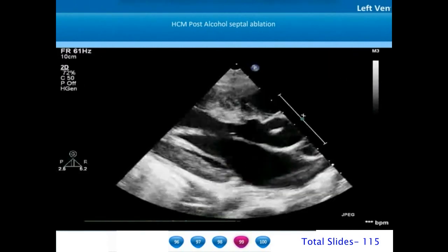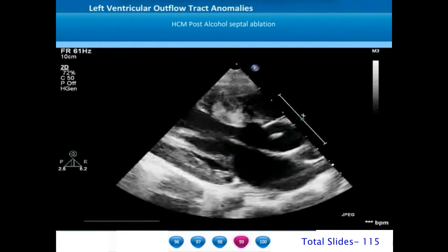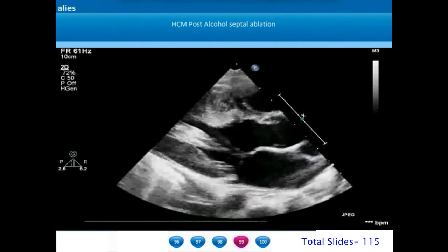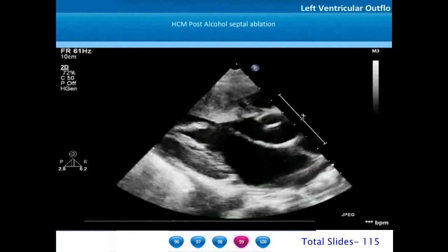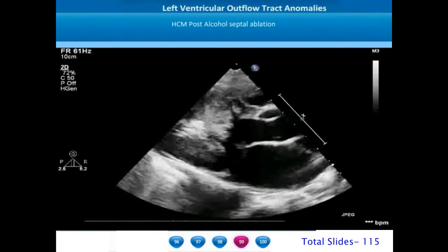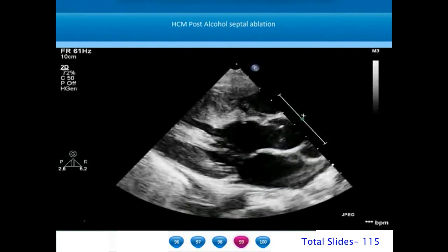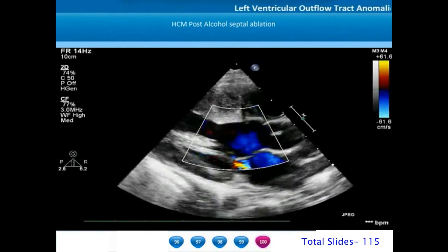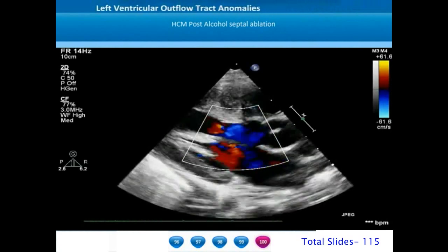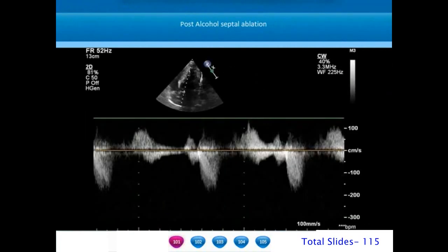One modality of treatment for hypertrophic obstructive cardiomyopathy in the interventional cath lab is to inject alcohol in the first septal artery to cause necrosis and infarction of the basal portions of the intraventricular septum overlying the region of SAM. In this example, a parasternal long axis view done on a patient who had hypertrophic cardiomyopathy and alcohol septal ablation about 3 months earlier demonstrates substantial reduction in LV mass in the basal intraventricular septum. On color flow interrogation there is no LVOT obstruction now and the mitral regurgitation has also come down substantially. Post septal ablation the LVOT gradient has reduced to less than 2 meters per second.